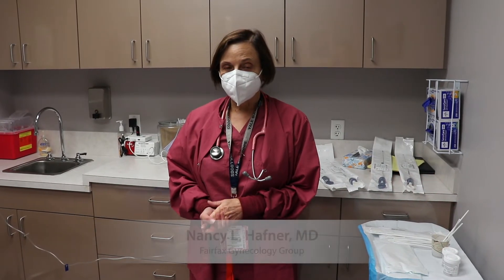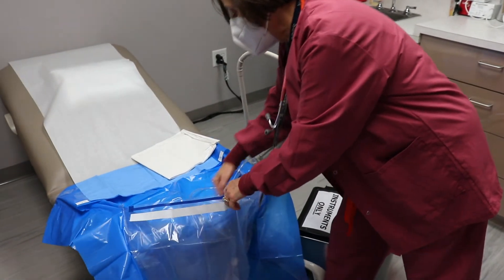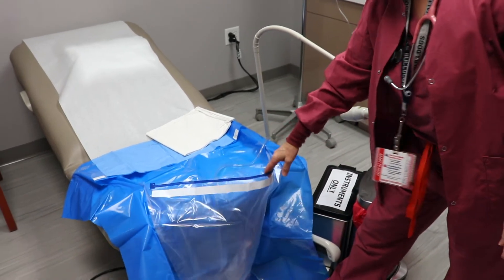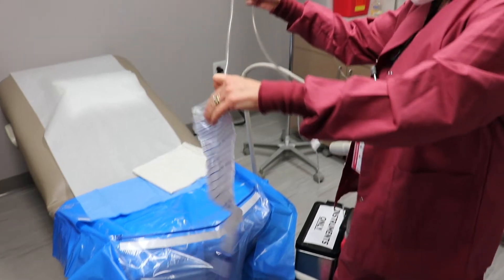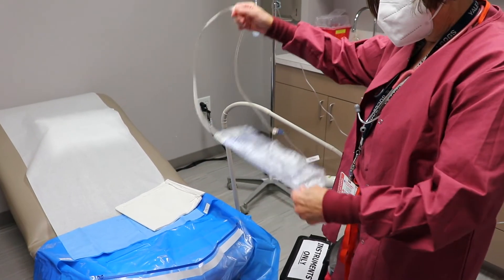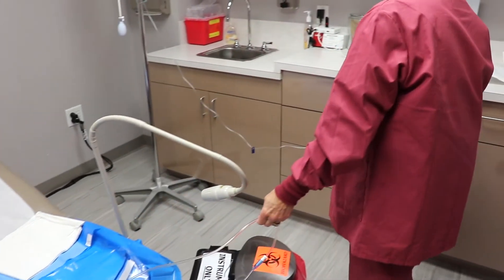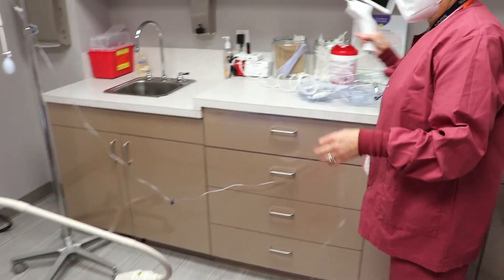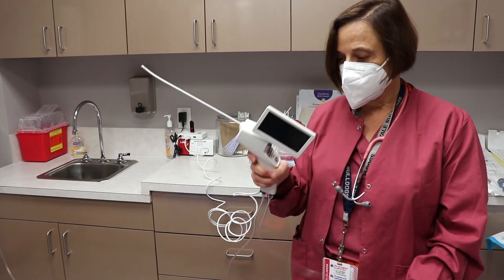Let me show you the equipment we have for the hysteroscope. First, we have a draw sheet with a little bag in it so that fluids can collect there. And then we have a little bag that we can measure the outflow if we need to. This tubing goes to the outflow of the hysteroscope, and this is the device.